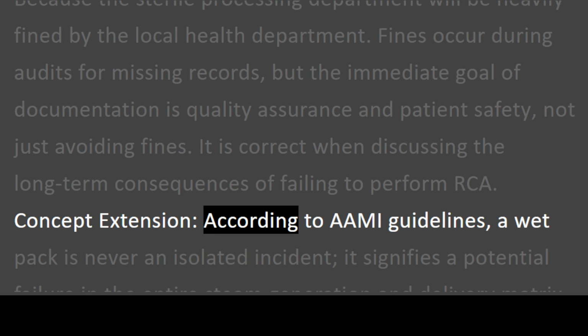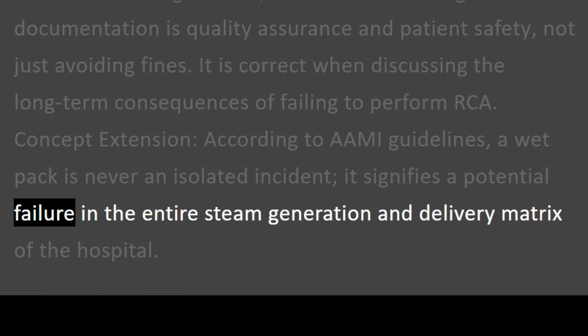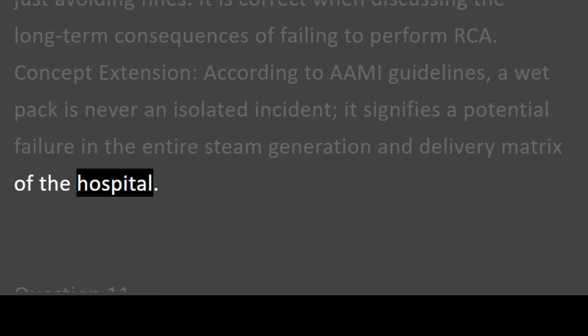Concept extension. According to AAMI guidelines, a wet pack is never an isolated incident. It signifies a potential failure in the entire steam generation and delivery matrix of the hospital.